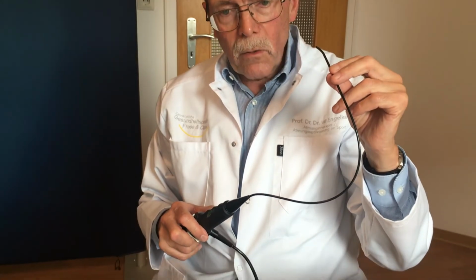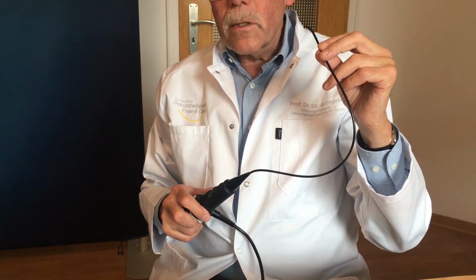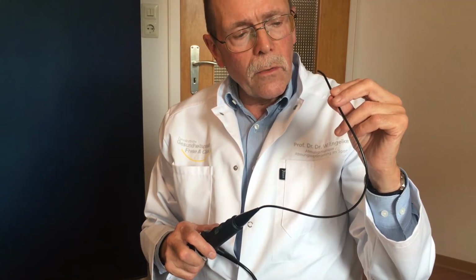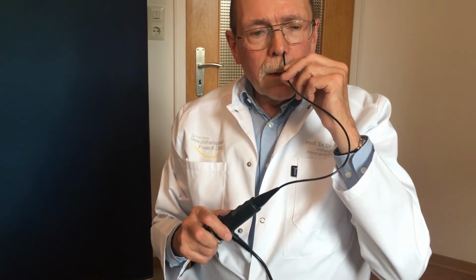This endoscope can be placed into the nasopharynx to be used in judging the patency of the airway. So I place the endoscope this way through the nose, and we can observe through the nose, using it directly to the airway.